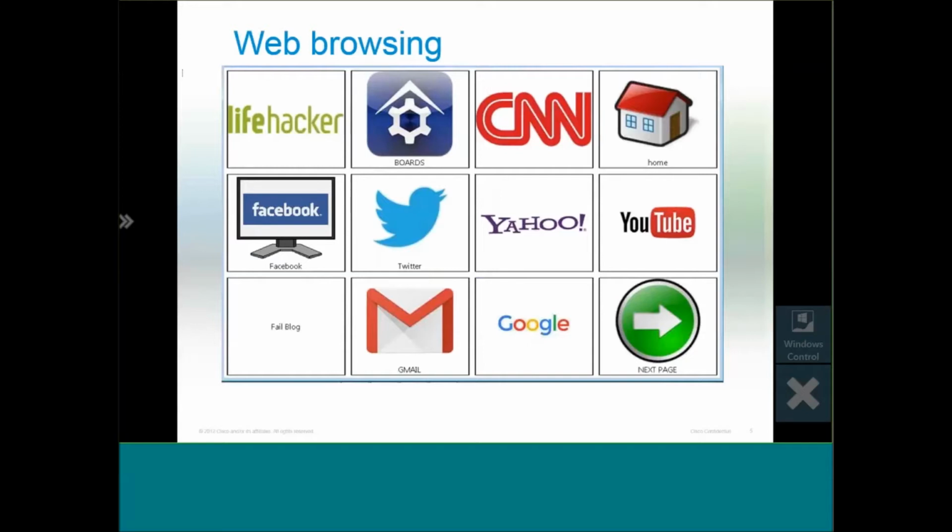I found a really useful page set in SonoKey called Minimize SonoKey. It creates a small pop-up window so you can see most of your screen, but at the same time allows you to easily go back to SonoKey. I modified that page set to help with web browsing. So the pop-up allows you to use the browser back button, close tab, or the whole browser altogether, or go back to your list of favorite websites.